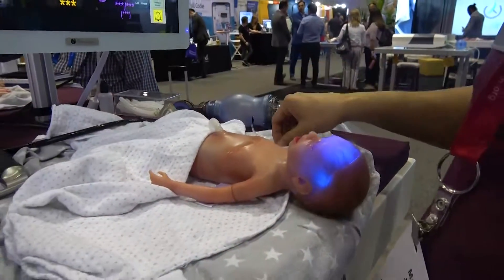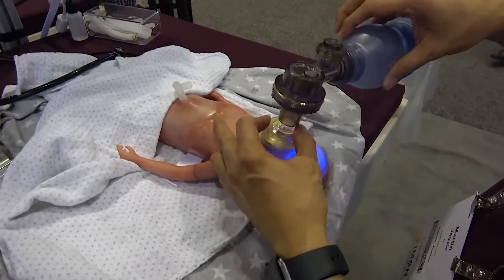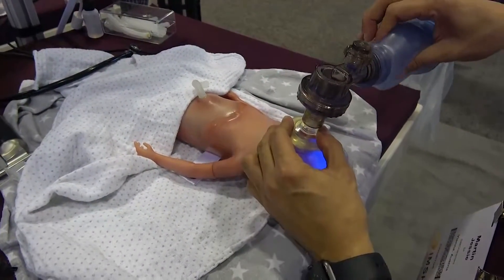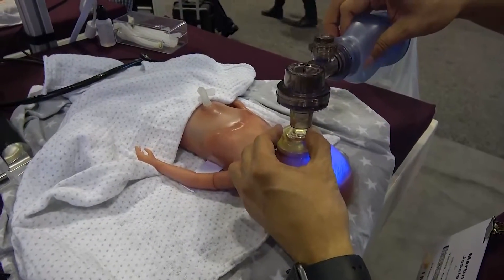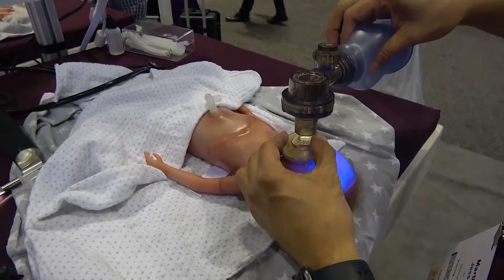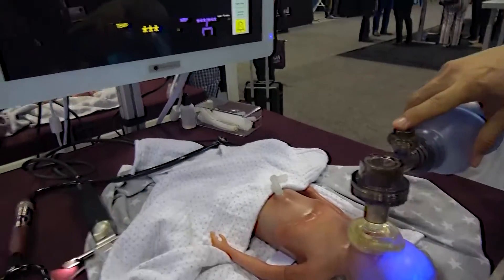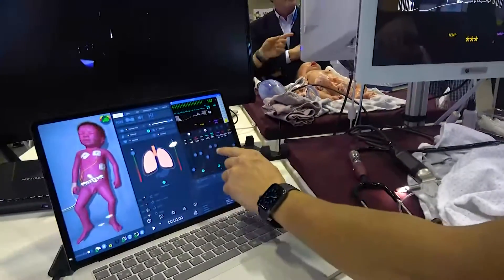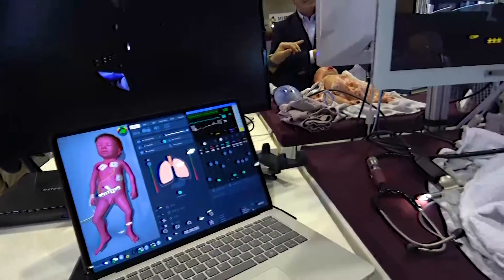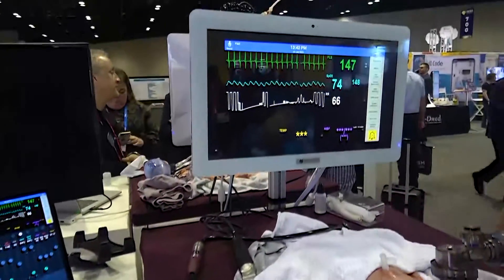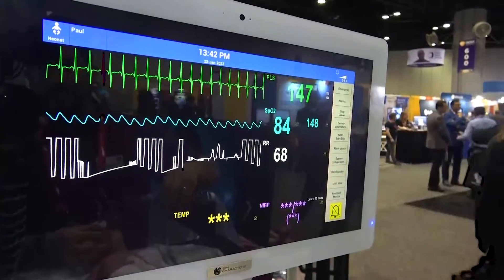The first thing is I can bag Paul. If I bag Paul wrong, I see I'm only ventilating the belly. Now if I ventilate Paul in the correct position, I can see that I have chest movement, and now I could stabilize Paul and saturation would go up. Paul is going up with his vital signs and I stabilize Paul.